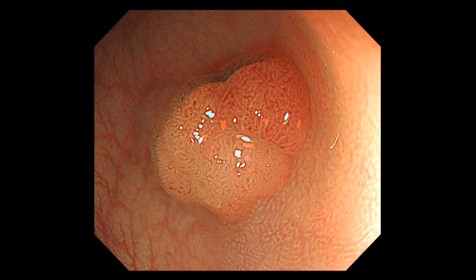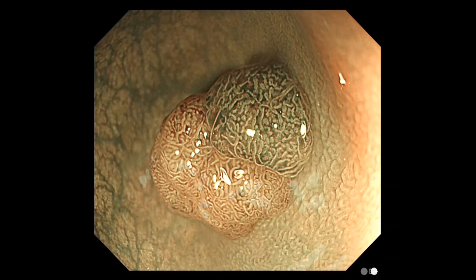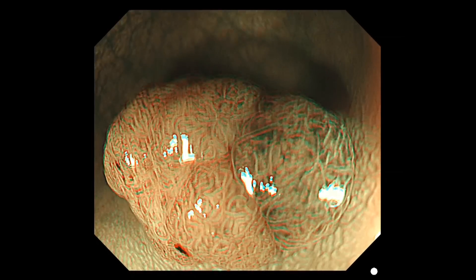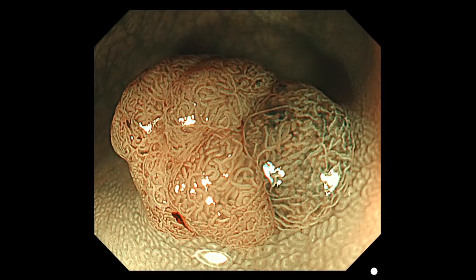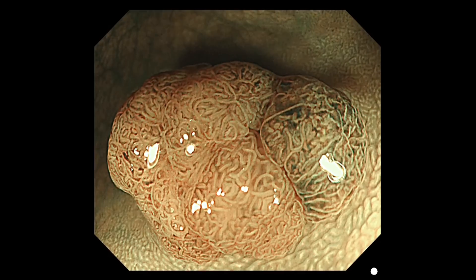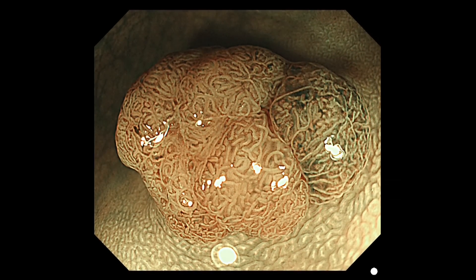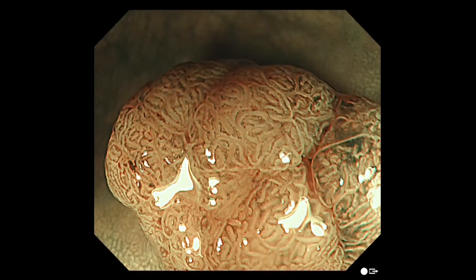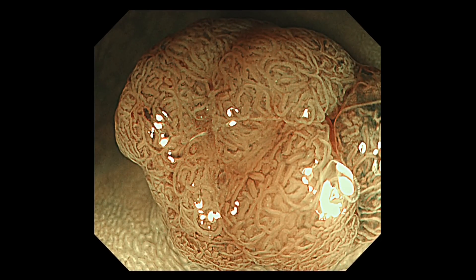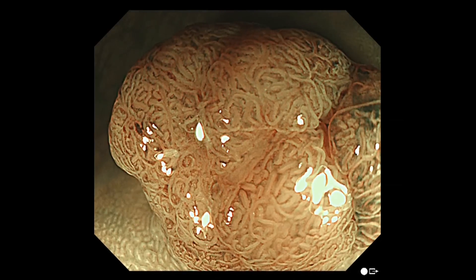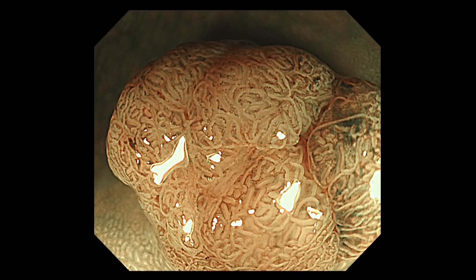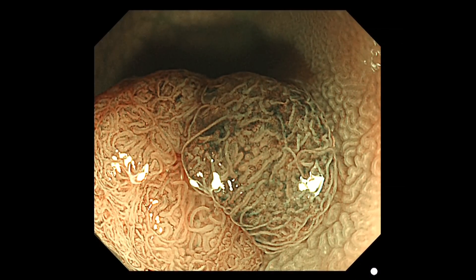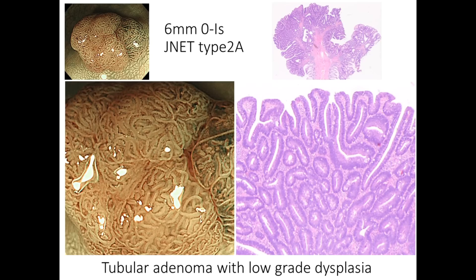This is a sessile polyp 6 mm in diameter. In magnifying NBI view, tubular and branched structures can be observed on its surface. Each microvessel has similar thickness and regular distribution, and is spiral in form. These are the typical findings of polypoid lesions for J-Net Type 2A. EMR was performed on this polyp, and the diagnosis was tubular adenoma with low-grade dysplasia.